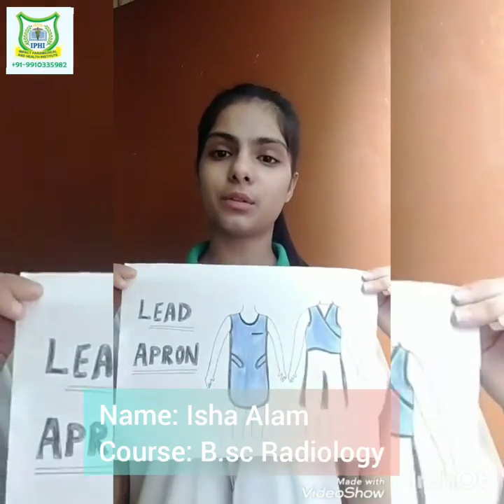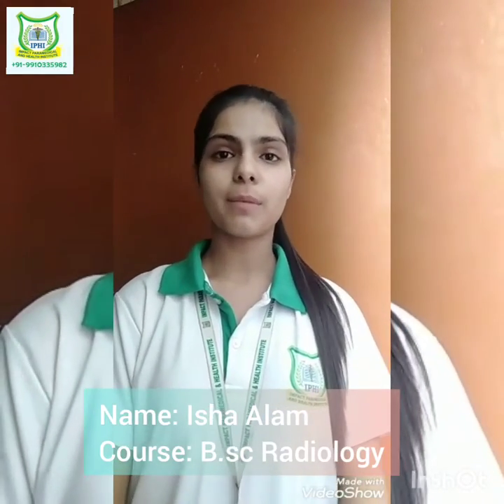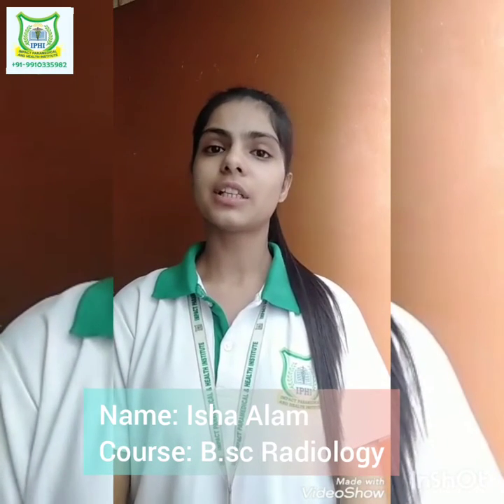That's how the lead apron looks like. Lead apron is a very important part in the field of radiology. It is worn by radiologists, radiographers, and radiation workers during radiation exposure to protect themselves from the harmful radiations coming from x-rays and all.